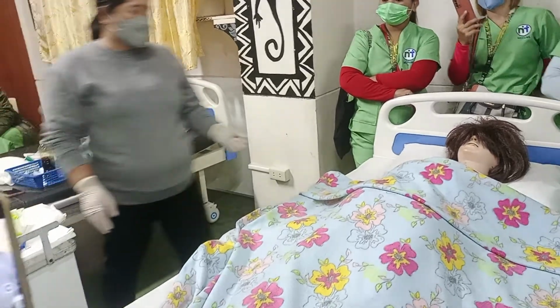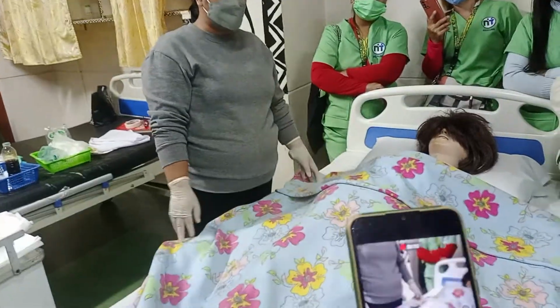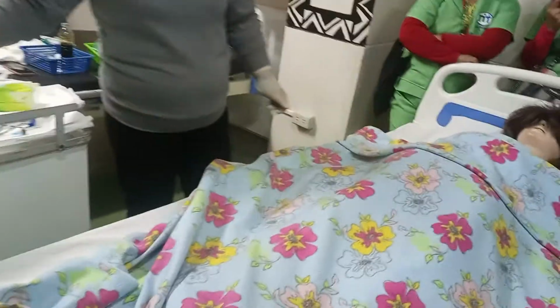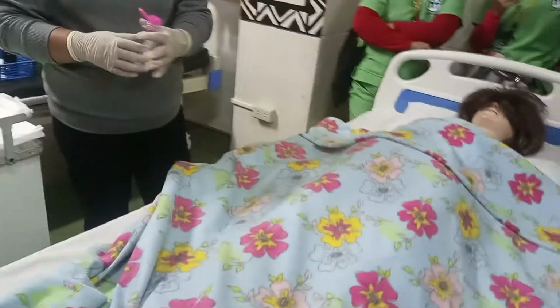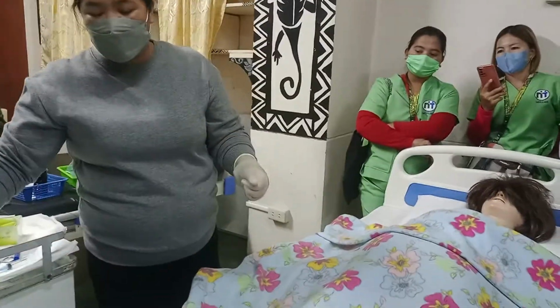So, again, good morning, Mrs. Smith. I am back and I am ready to do the procedure. Are you ready? Okay, daw. So, you sanitize your hands. Wear your clean gloves. Okay, not necessarily sterile gloves kasi magpupukod ka lang naman.